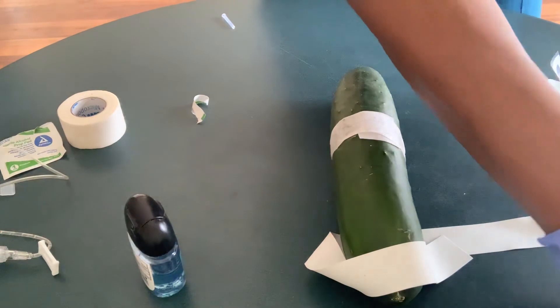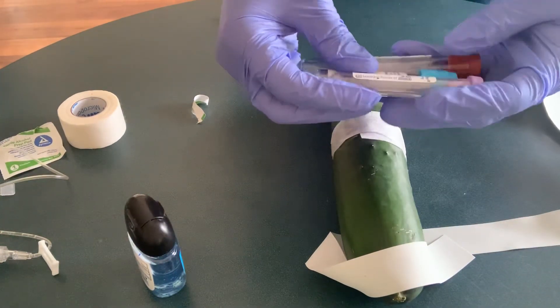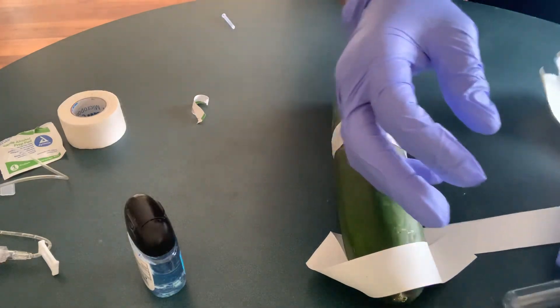Then I'm going to take my blood sample and label the tube very well, then take it to the lab as soon as possible. Thank you.